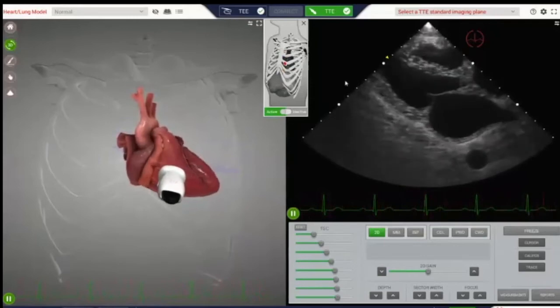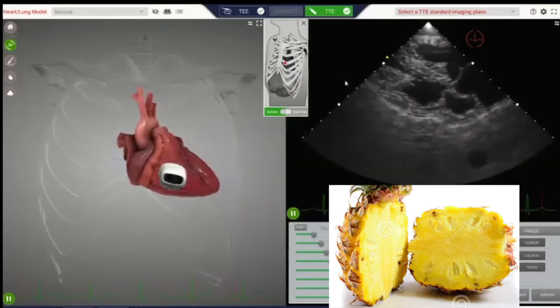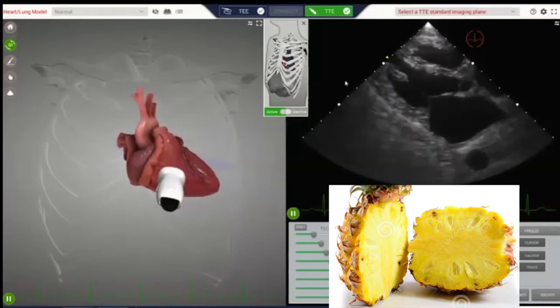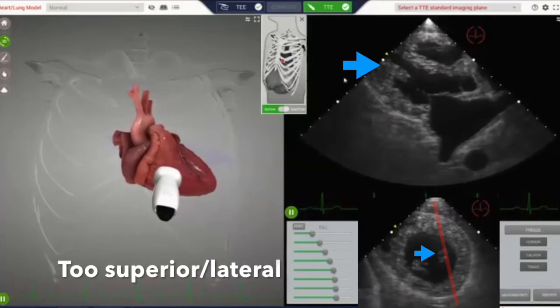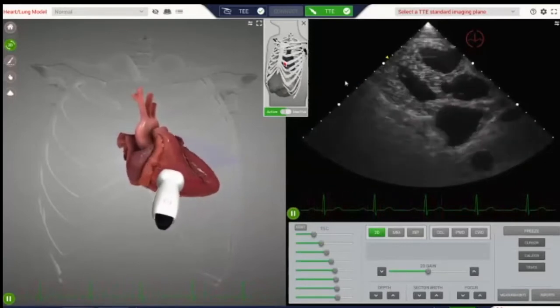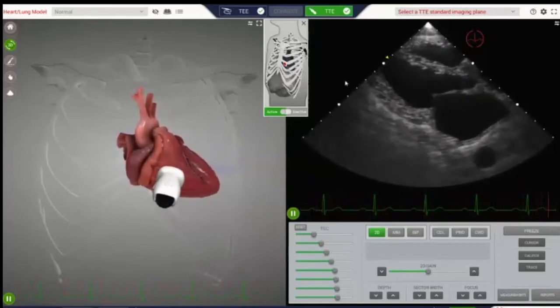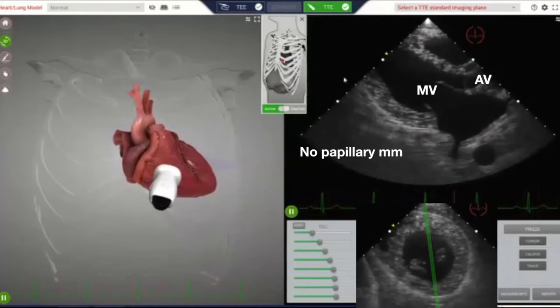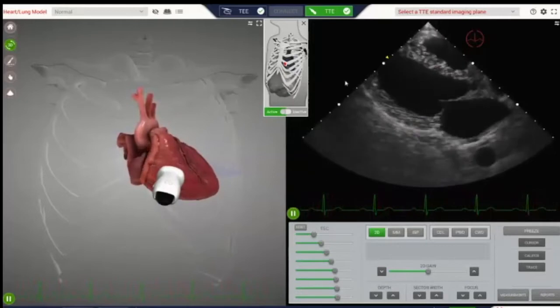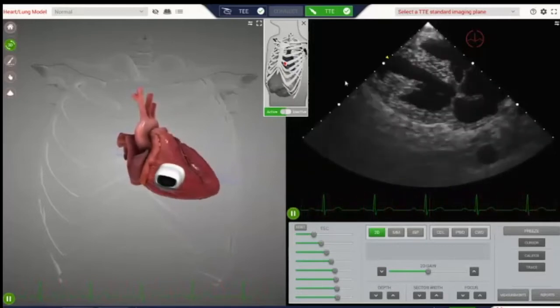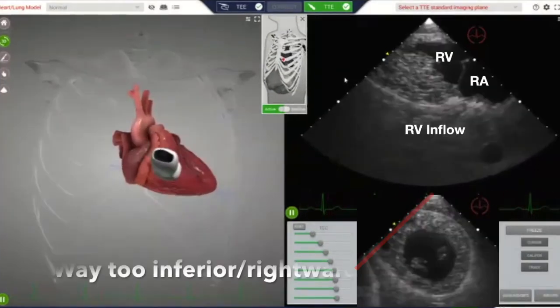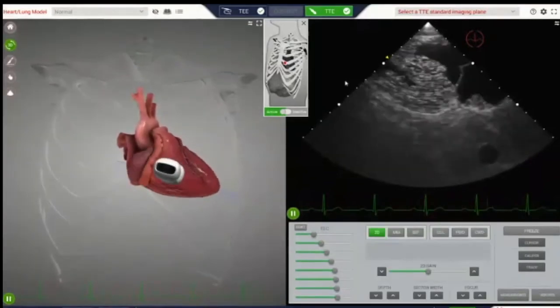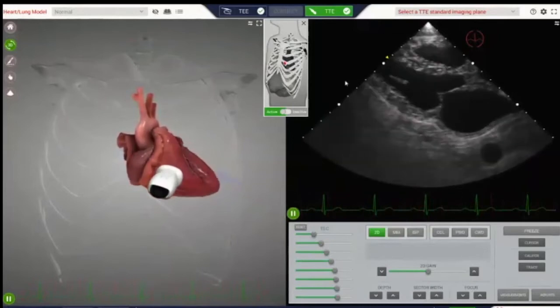With a good intercostal space free of artifact, imagine that the left ventricle is like a pineapple and that the parasternal long axis cuts through it from top to bottom. You want to tilt the probe so that the cut is in the center of the LV. If the scan plane is too superior, it cuts through the lateral papillary muscle and lateral LV wall. Tilt inferiorly to get back to the center — you should see the mitral valve and aortic valve with no papillary muscles. If you continue to tilt too inferiorly, you'll see the RV inflow view; recognize this and fan superiorly to return to the parasternal long axis.